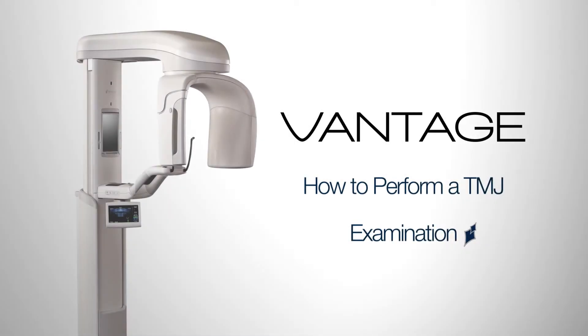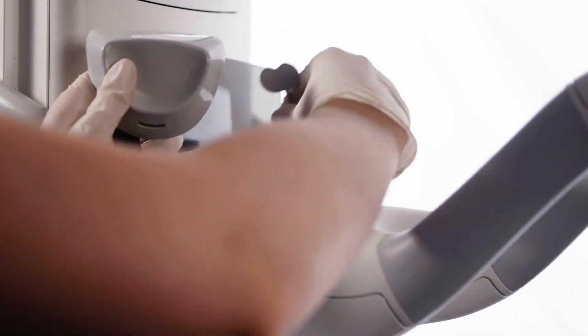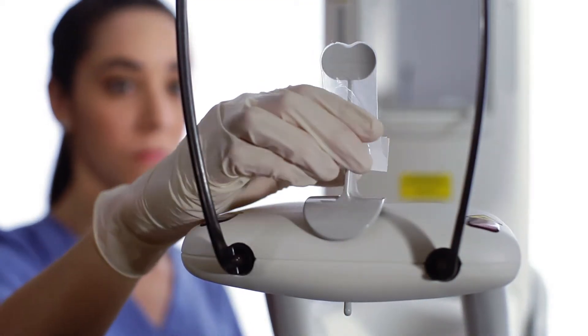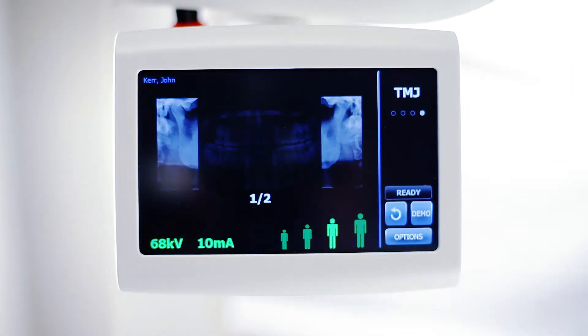How to perform the TMJ examination. To perform a TMJ examination, first exchange the panoramic bite piece and chin rest for the TMJ positioner. Choose the TMJ exam on the control panel.